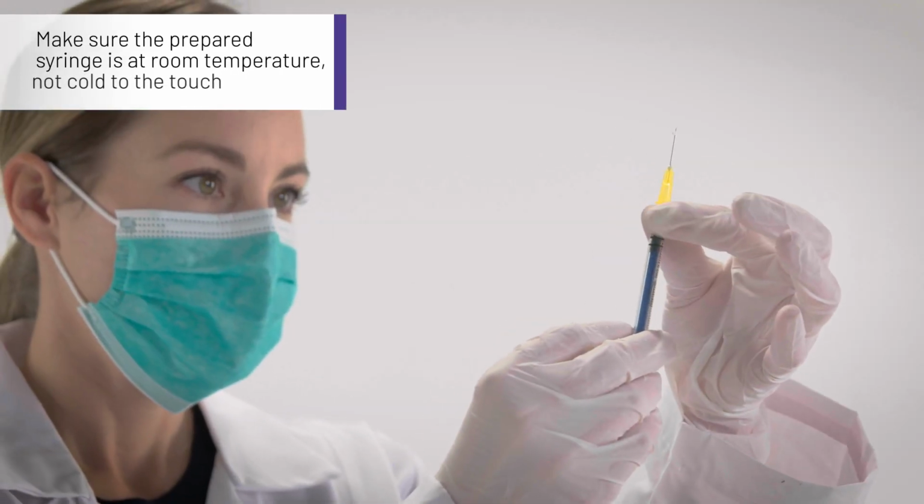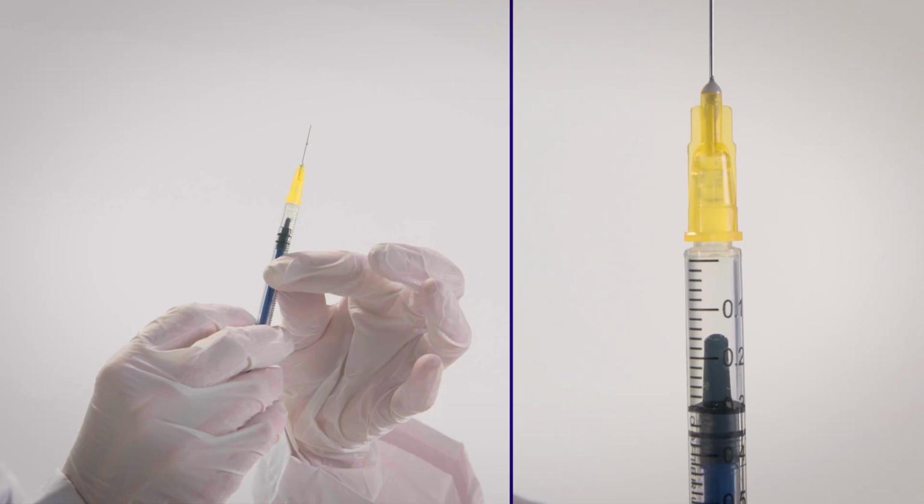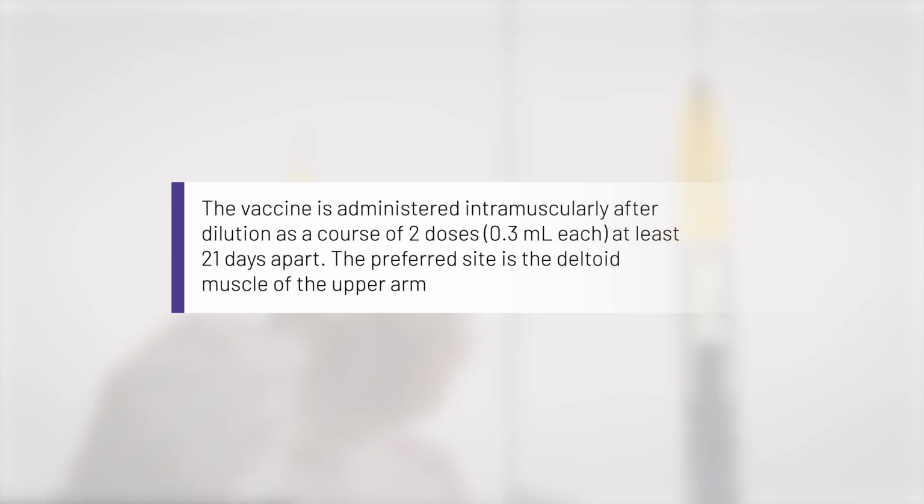Make sure the prepared syringe is at room temperature and not cold to the touch. Do a visual inspection to verify the final dosing volume of 0.3 milliliter. Each dose must contain 0.3 milliliter of vaccine. If the amount of vaccine remaining in the vial cannot provide a full dose of 0.3 milliliter, discard the vial and any excess volume. Do not pool excess vaccine from multiple vials. Prepared syringes should be administered immediately. Administer the vaccine intramuscularly. The preferred site is the deltoid muscle of the upper arm.